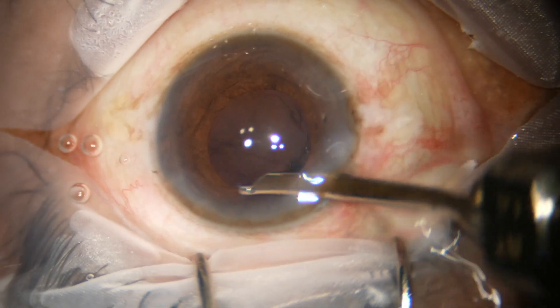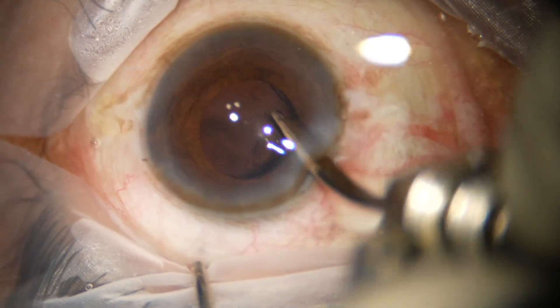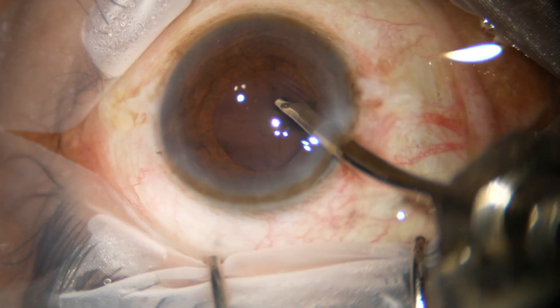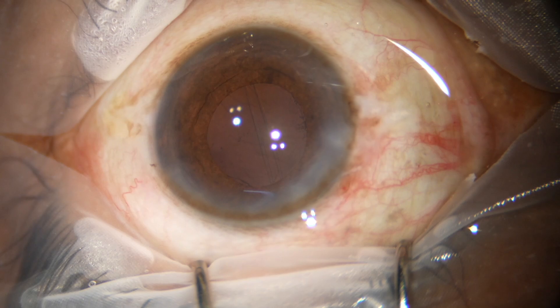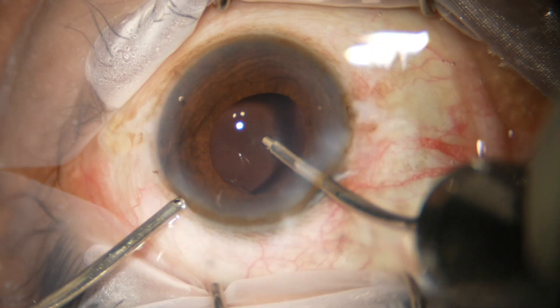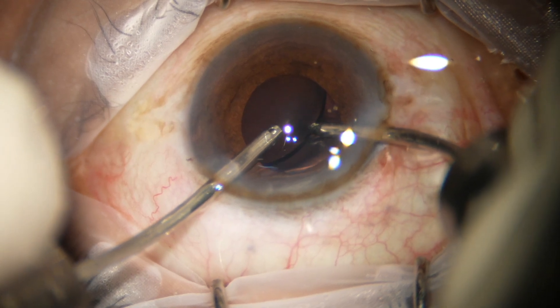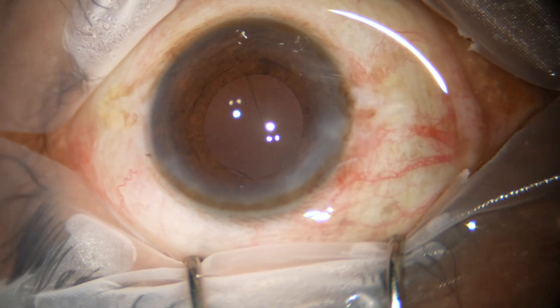Now I have to remove the visco thoroughly. First I use the 23-gauge Simcoe and irrigate the anterior chamber, then I go behind the intraocular lens and irrigate the posterior chamber and the capsular bag. Now I use bimanual irrigation aspiration — the irrigating probe in the right hand and aspirating probe in the left hand. While I use the irrigation, I simultaneously lift up the anterior wall of the main wound so leakage of fluid is minimized. The irrigation is behind the lens and aspiration above, so all visco in the capsular bag is removed.